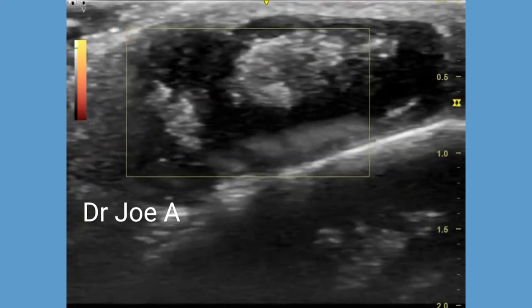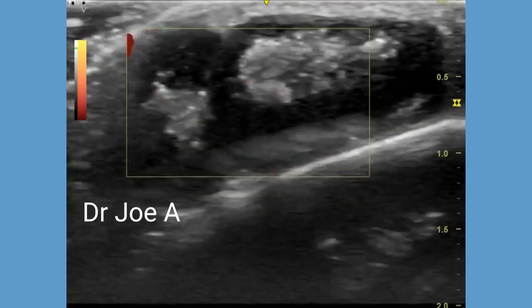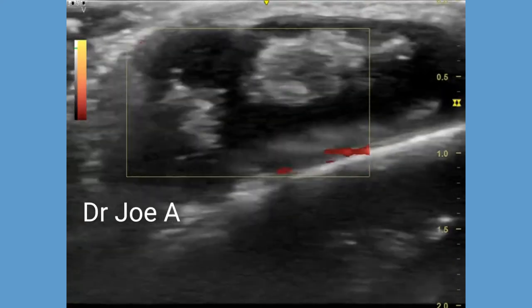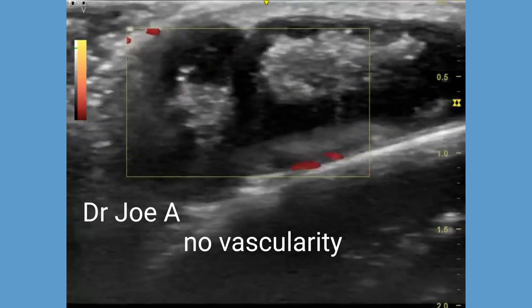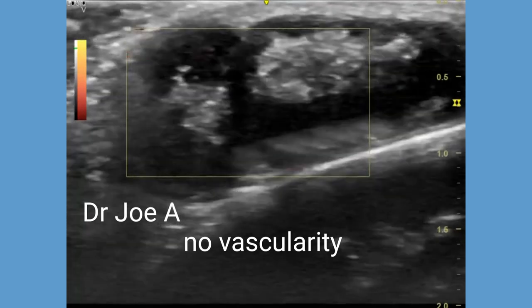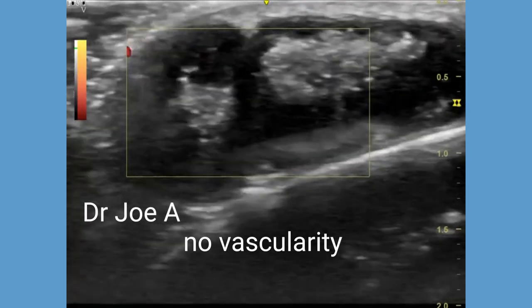A trichilemmal cyst is also not vascular on power or color Doppler.